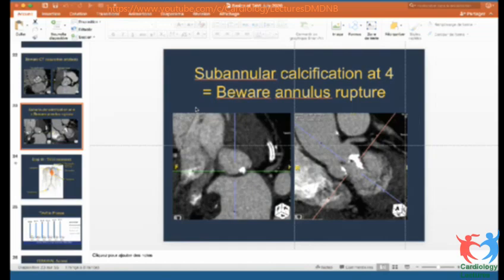Yes, also if you have renal damage, in all the trials they said that with the self-expandable you can use more iodine. So if you want to use less iodine, you can go to the balloon expandable also. And if you have a young patient, and you don't want to have a pacemaker after the TAVI, you can also do balloon expandable, because you have less pacemaker need with the balloon expandable than the self-expandable. Less AKI, less pacemaker.